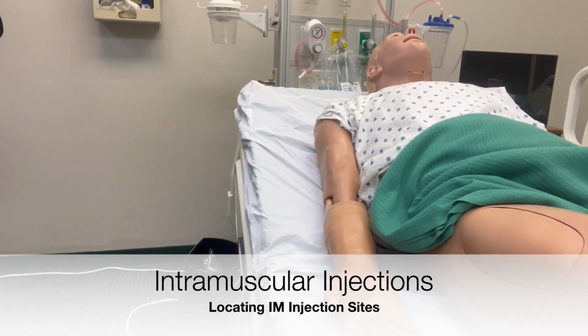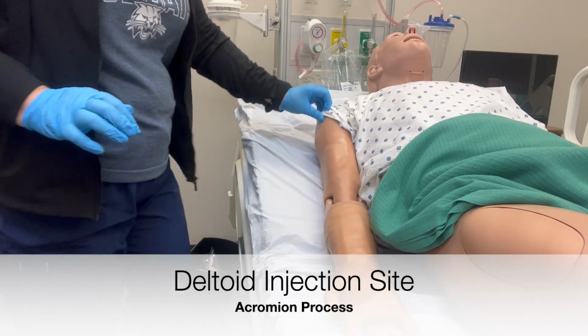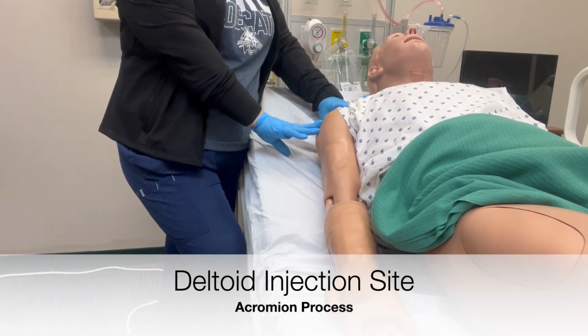All right, so the next thing we need to do is look at the actual administration sites that we can give an intramuscular injection in. So the first one and most common is the deltoid. The deltoid is the muscle in your arm.